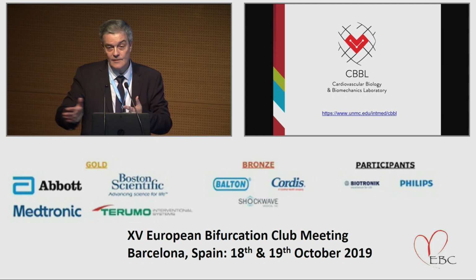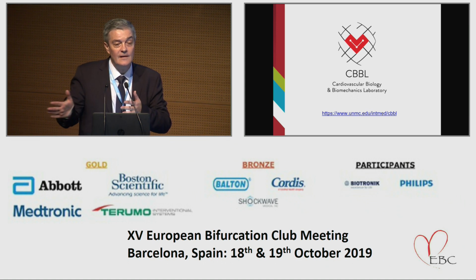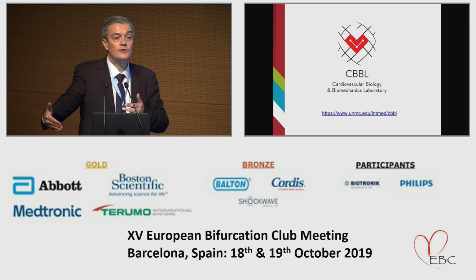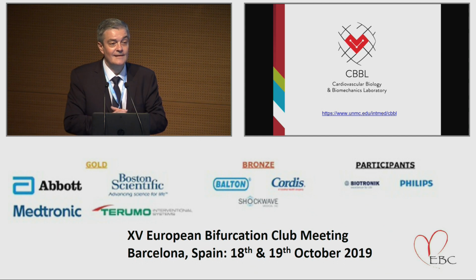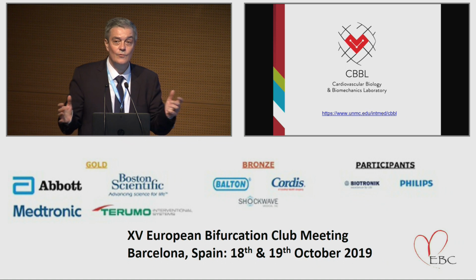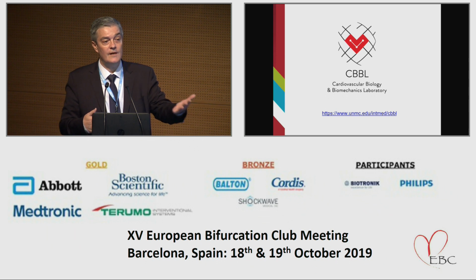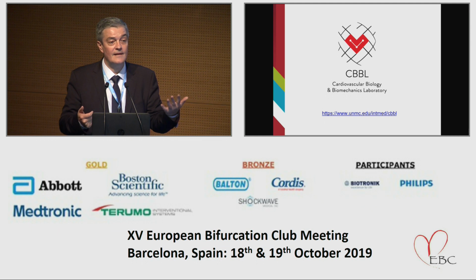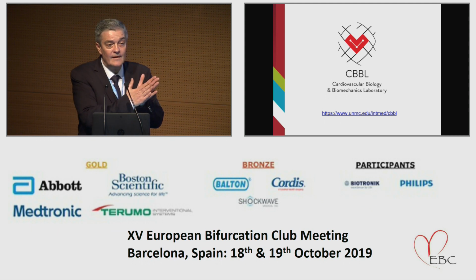By going distal, you actually scaffold partially the ostium of the side branch, and having that protrusion of the metal, you decrease the amount of protrusion of the second stent inside the main vessel. It's a long-lasting discussion and dilemma. We try to convey the message that T and TAP are actually the same. It's just how much you pull back your stent, and you should try not to protrude unless it's really necessary. And it's really necessary if you cross proximally or if you have a very narrow angle.